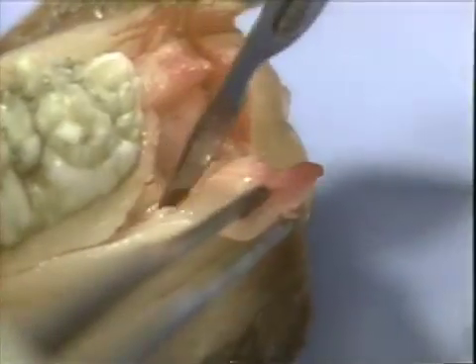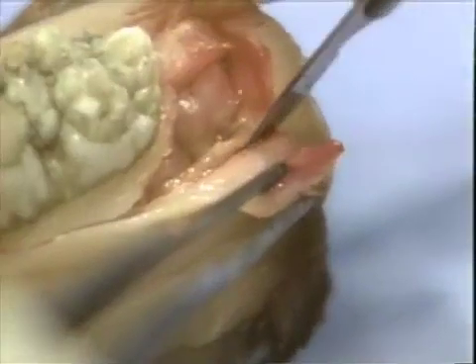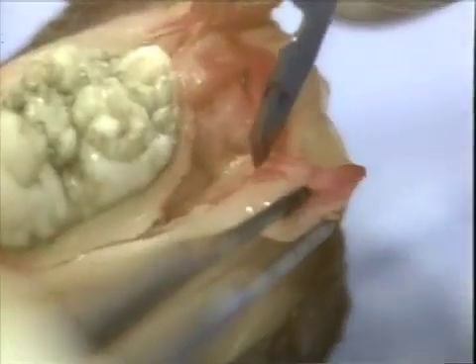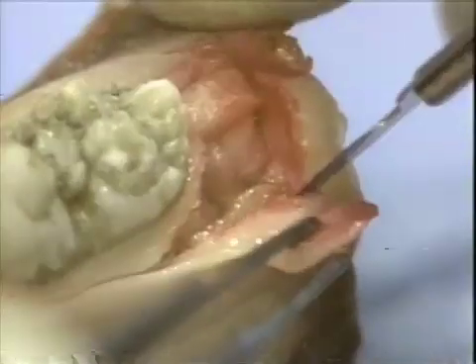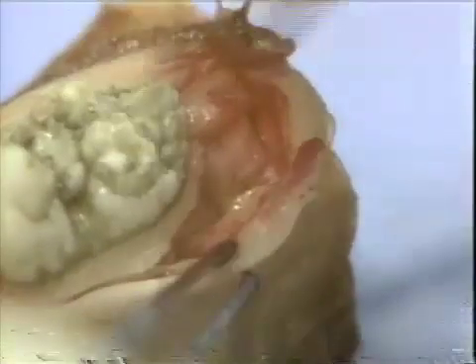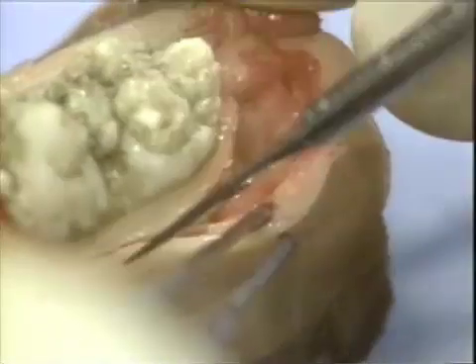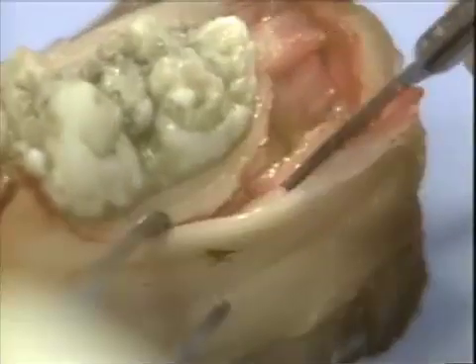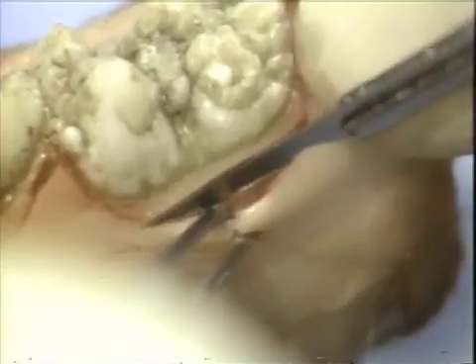In this case, you can see that an unerupted molar tooth is present in the retromolar area in the pig jaw. We will disregard this finding and treat this area as a typical distal wedge procedure. The operator ensures that the incision is continuous to the crestal bone from the anterior flap area through the distal line angle of the terminal tooth and into the distal wedge area.